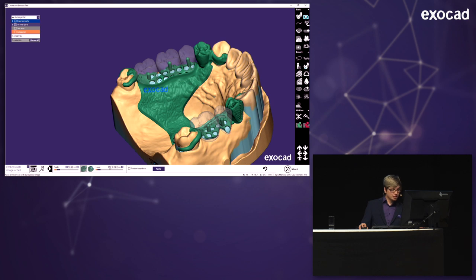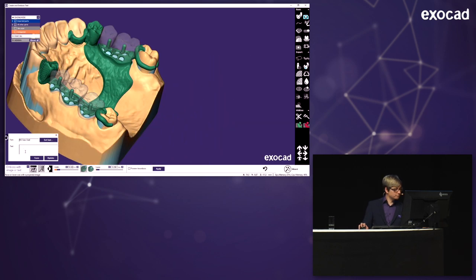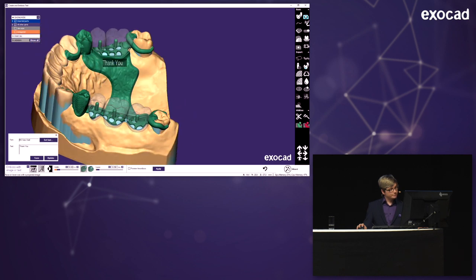So here I can change how much it will get lowered or raised up. I'm just lowering it a little bit. You can also add text here. I can put in nearly anything. Just rotate it a little bit and apply.